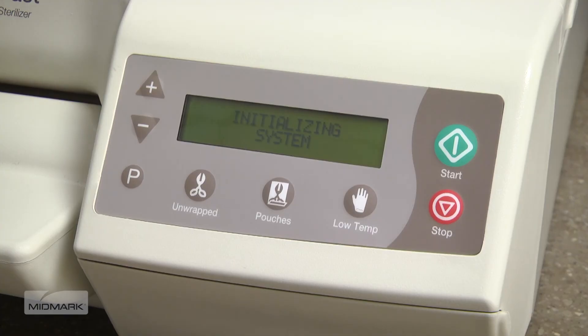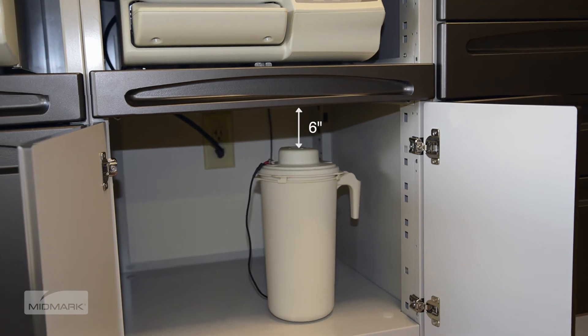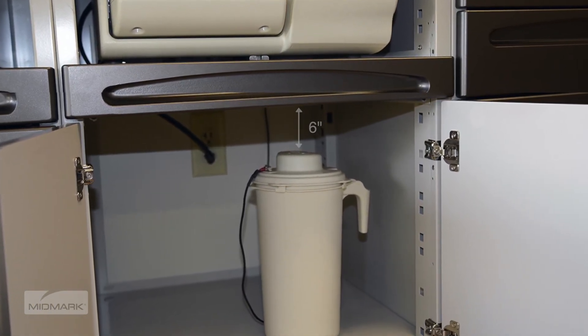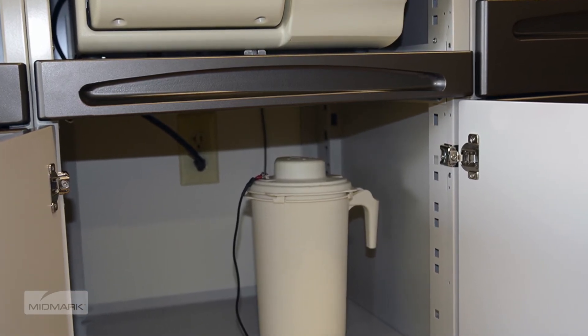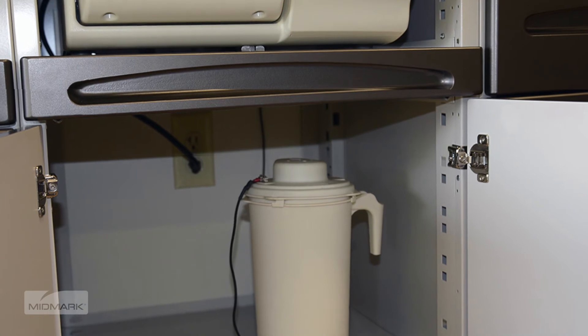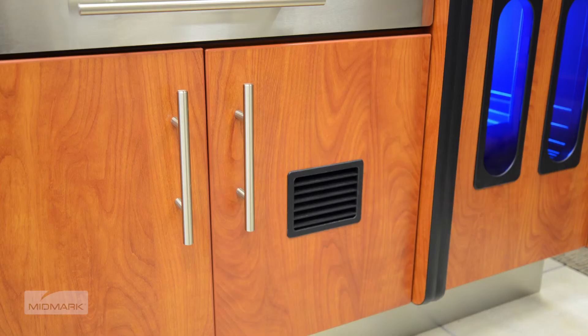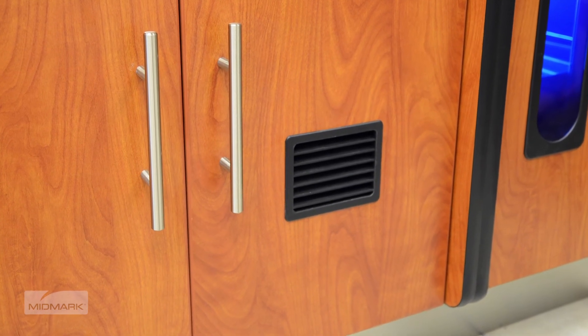This message will then appear on the display. Maintain a minimum of 6 inches of clearance above the condensing tank for proper steam ventilation. If enclosed in a cabinet, the support surface and surrounding surfaces should be protected with a water-resistant material, such as plastic, laminate, or stainless steel. It's also recommended that the door be vented to avoid heat, moisture buildup, and potential damage to the inside of the cabinet.